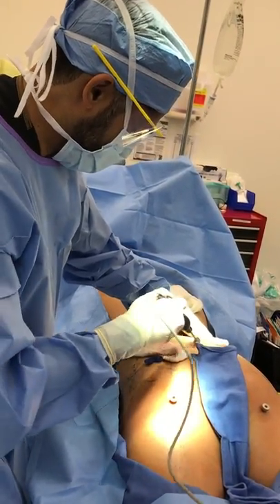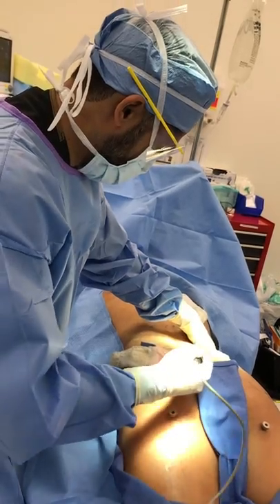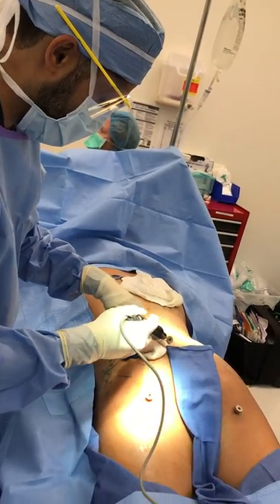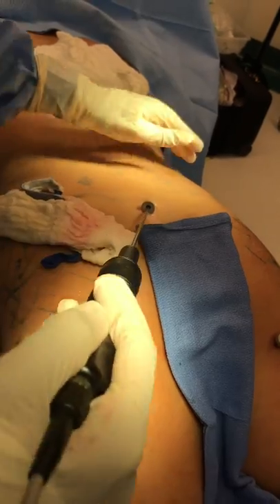We're vasoring right now — we're doing a Brazilian butt lift — and this vaser goes and helps to melt the fat. You can see, if you come around here, some of the fat coming out right here, and that's the fat after it gets dissolved.